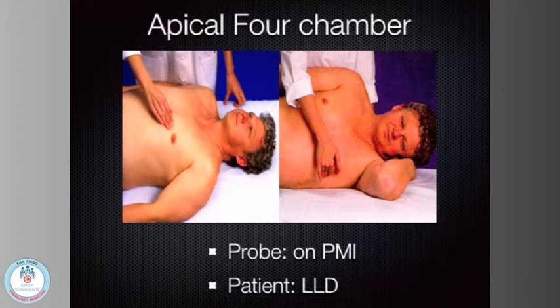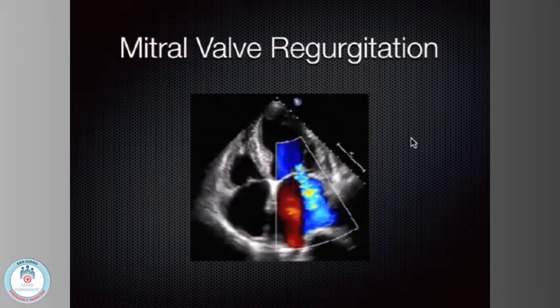heart right to the chest wall, and you get that PMI right underneath the nipple, the point of maximal impulse, the dime-sized area on the chest wall, where the heart actually comes right to the chest wall. It's a tiny little spot. It's hard to find, but when you find it, it's a lot of information coming at you. So roll the patient on their side. Putting the arm up helps open up the ribs a little, I think, and you get back to here.